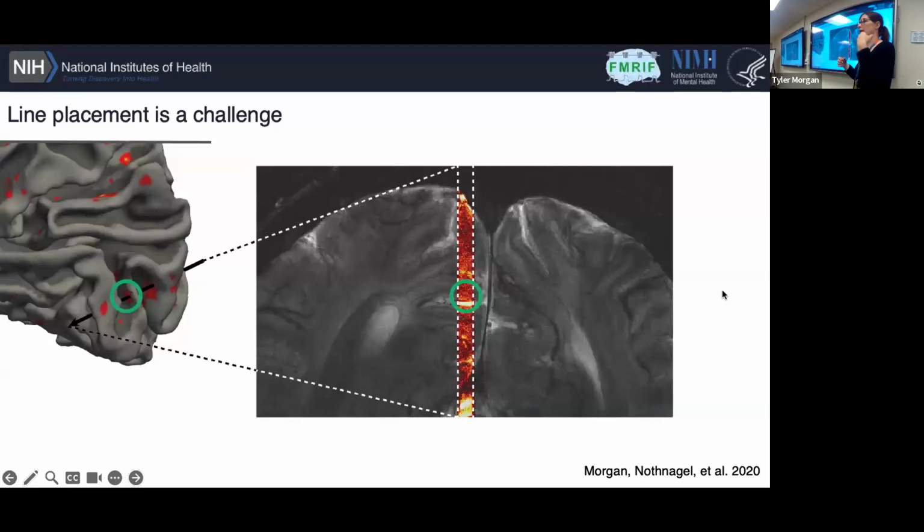And this just minimizes that effect that I was talking about, which is essentially that you don't have bleeding of different layers into different voxels of your signal. It tries to make them as independent as possible in each of the voxels.